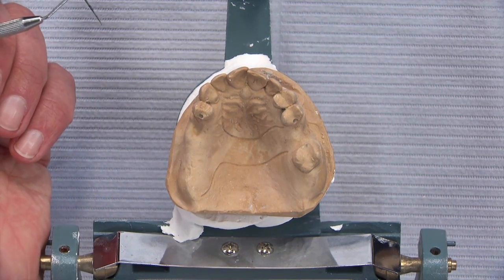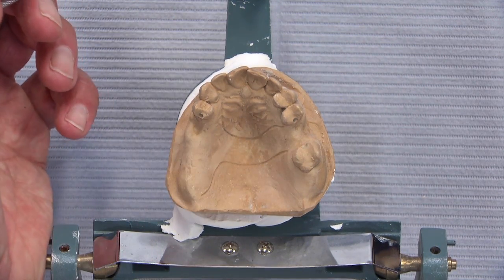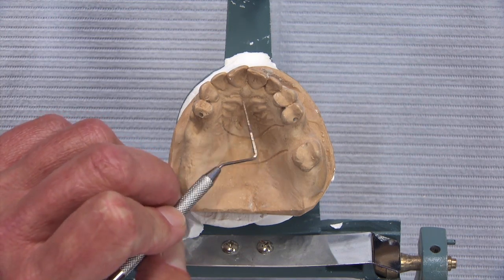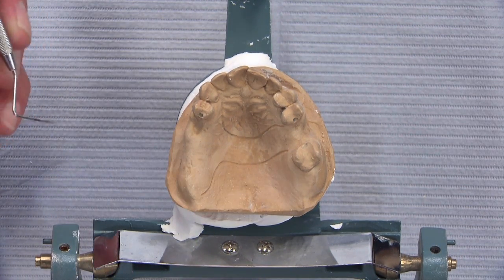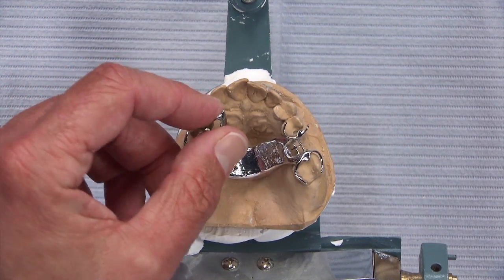The lingual clasp works well because there's no undercut on the distal of that tooth. The designer also noted the patient has a significant prominent rugae that needed to be relieved, and the tissue undercut would need to be blocked out, leading to a really bulky major connector sitting over that area. So the designer suggested a palatal strap instead — and you can see it will stay clear of all the palatal rugae in the anterior portion of the palate. The doctor agreed and said go for it.